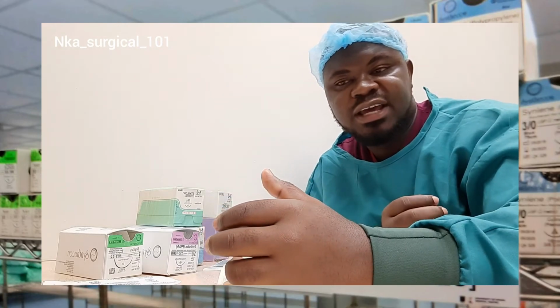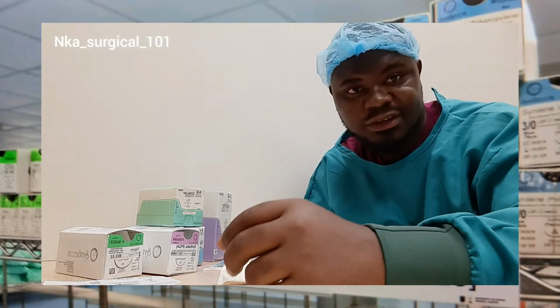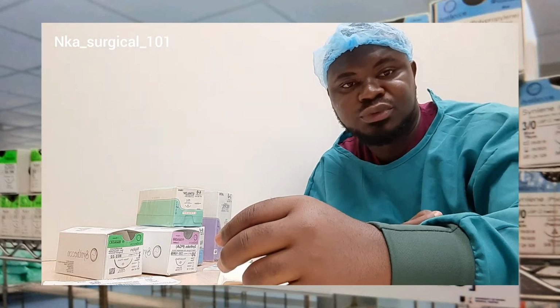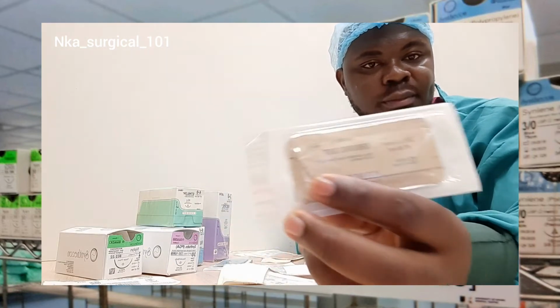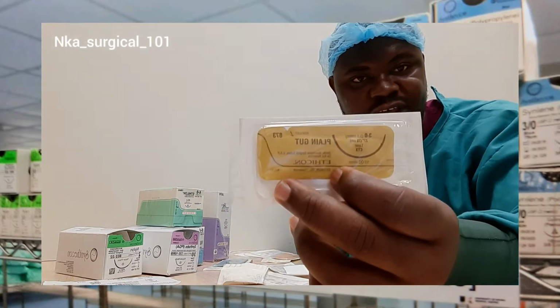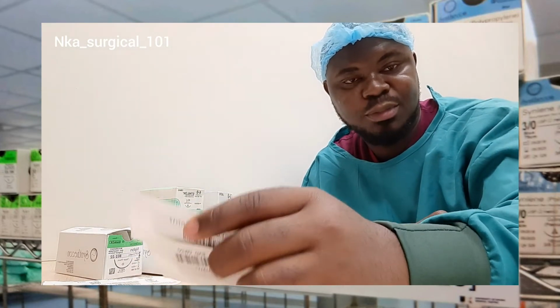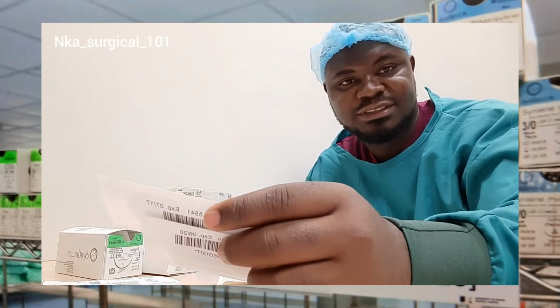Then talking about the natural absorbable sutures, they are called natural absorbable sutures because they are made out of the tendons of certain animals. That's why it's called the natural absorbable suture. An example is the gut sutures, such as the chromic cat gut, which is a natural absorbable suture. Another example is the plain cat gut suture, and they all fall under the natural absorbable sutures because they are made from the tendons of certain animals. That's why they are natural.